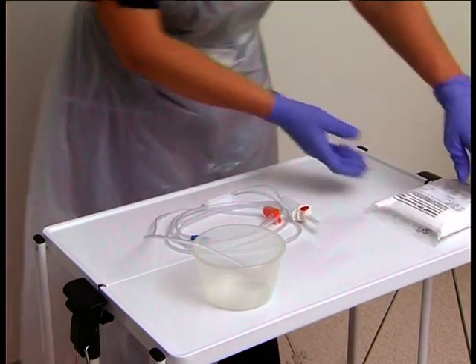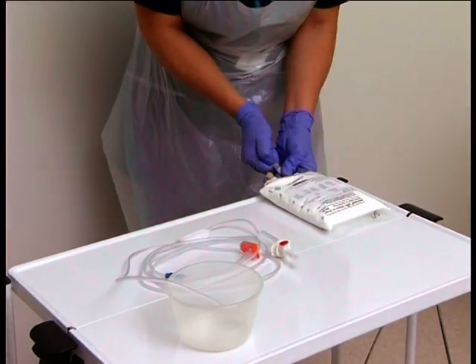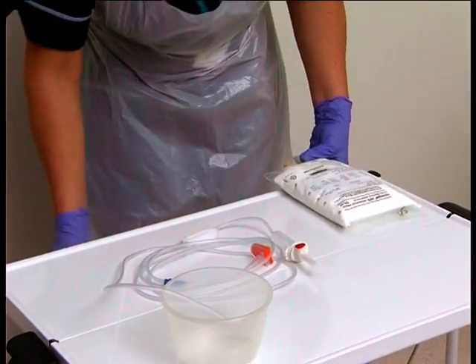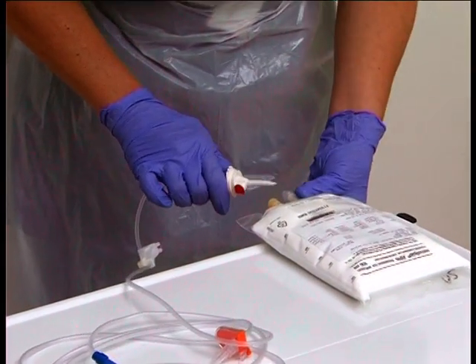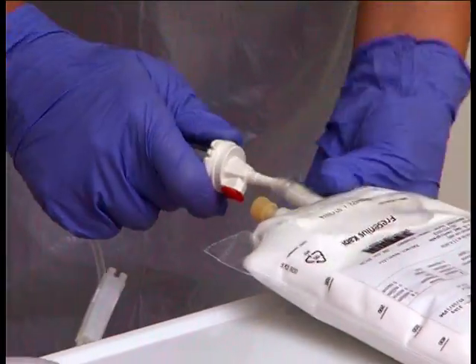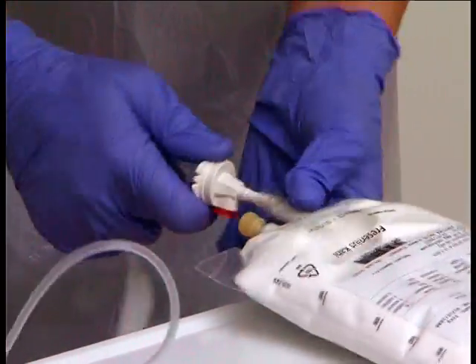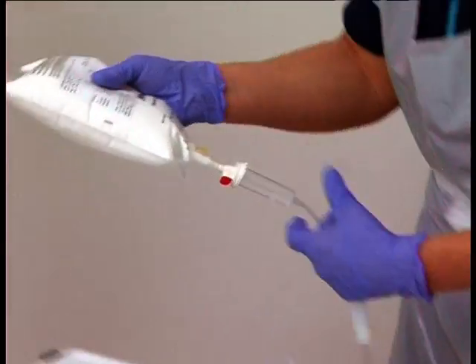Remove the cap from the connection port on the fat infusion bag, taking care not to touch the key part. Using a two-hand technique, remove the cover from the giving set spike. Join the giving set into the infusion bag, taking care not to touch the key parts or twist the giving set. Hang the bag on the infusion stand.